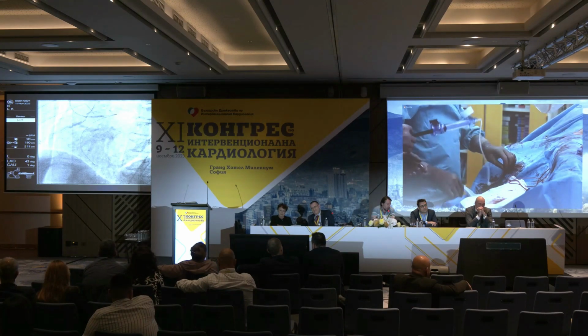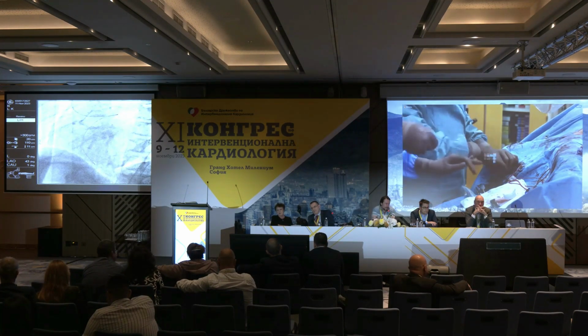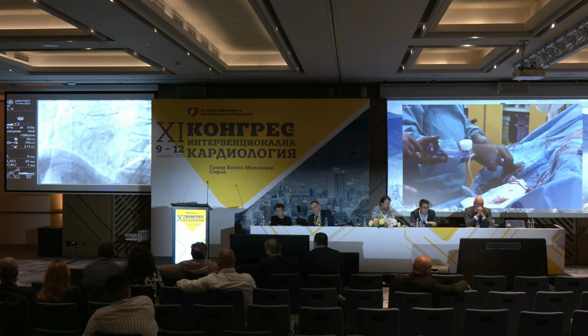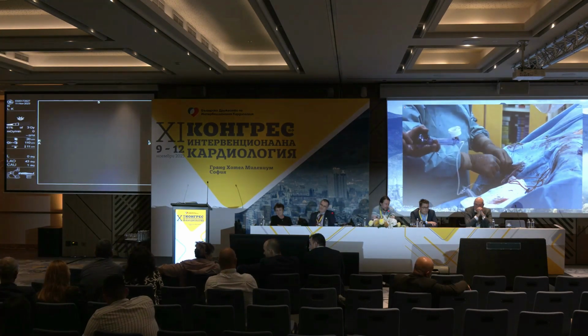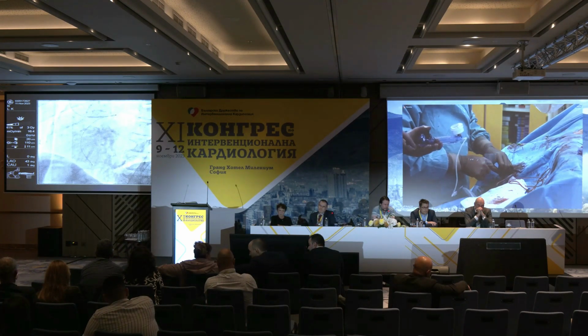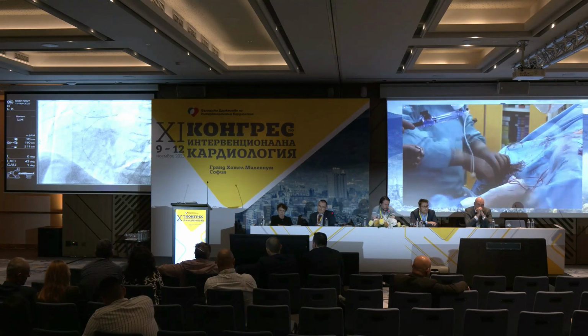So let's remove this wire anymore. Is this cranial? This is steep LAO, it's not cranial. We open the 4.5 balloon. Yes. Okay, let's have this 4.5 balloon. I'm not going to do tracking of the guiding over the balloon. I'm just going to retrieve this and I will insert the guiding catheter into the stent after the post-dilatation.